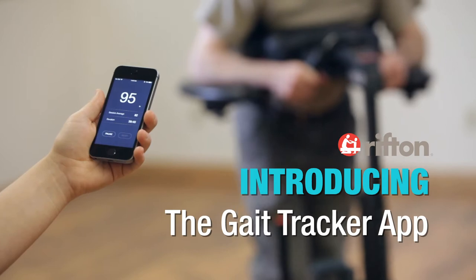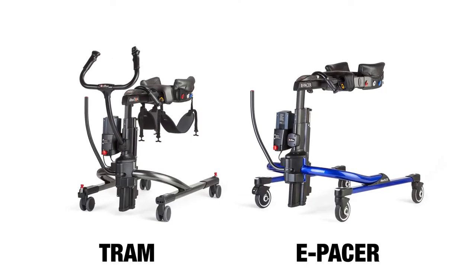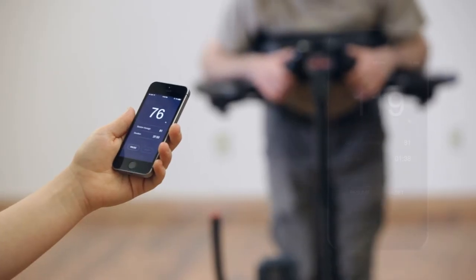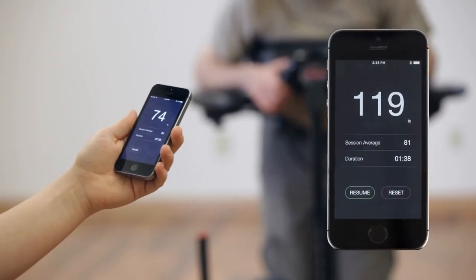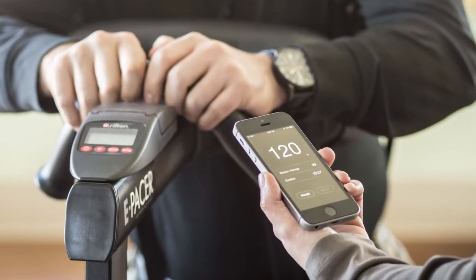The Gait Tracker app uses a Bluetooth connection to display data from the tram or ePacer scale on mobile phones and tablets. It measures and displays weight as a running average. It also measures the cumulative average and duration for a gait training session.